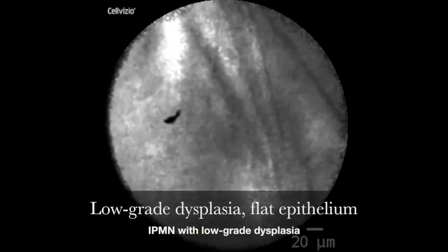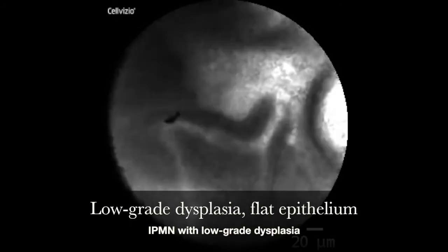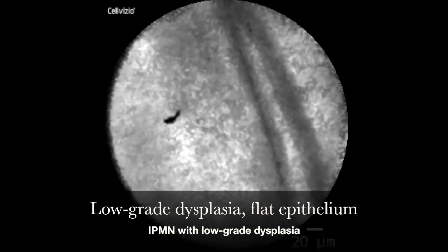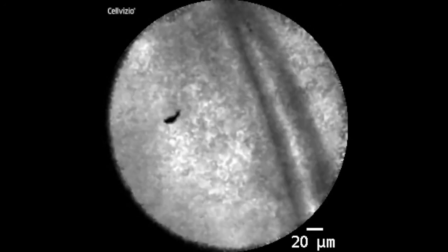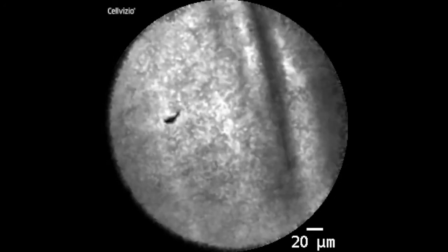Now here is IPMN in comparison. You see that this is an IPMN with low-grade dysplasia. You see layering of epithelium, and there is some type of papillary configuration, but you can hardly differentiate. But there are hardly any inflammatory cells in the background, and you never ever see this dark background with bright particles which we see in MCNs.